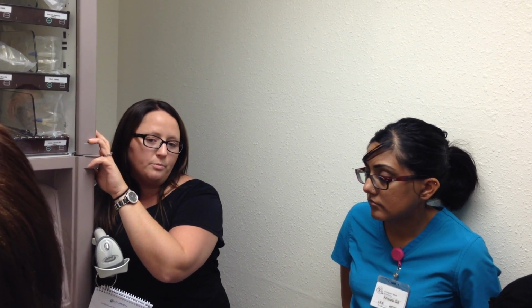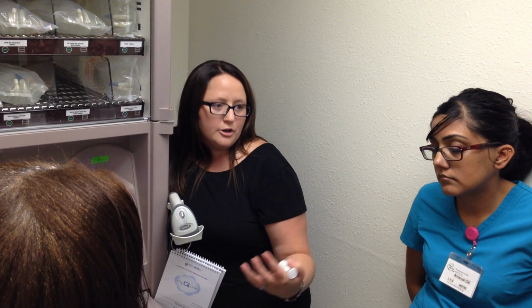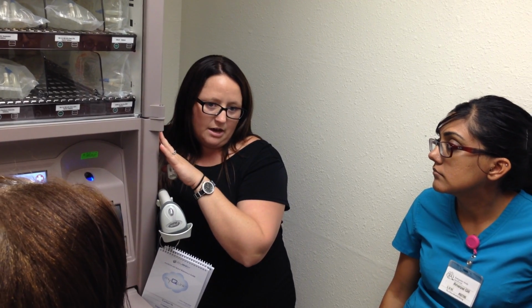When controls open up, there's gonna be a screen before this. It just automatically goes to take something out with this one, but with controls, it's gonna ask you to declare how many are in there before you take anything out. So the easiest way for me to reference this to your everyday life is that when you start your shift and you count the control drawer or your narc drawer, you're counting what you have right now at the start of your shift, not how many are going to be in there when you're done with your shift, right? Same thing here. It's what you found in there before you take anything out.